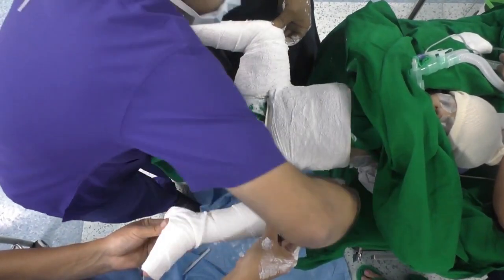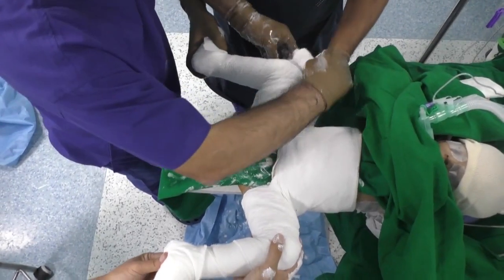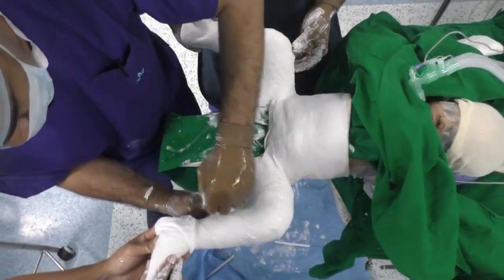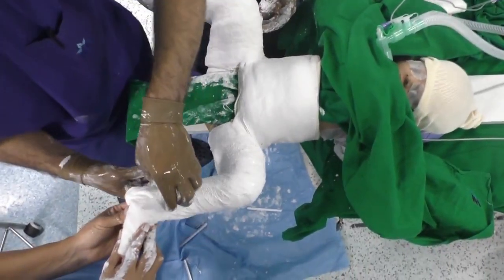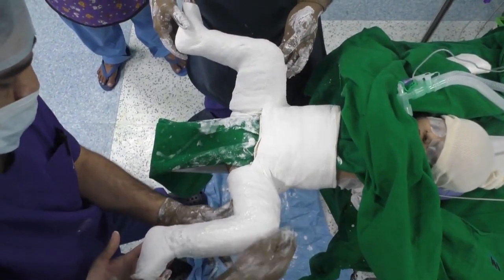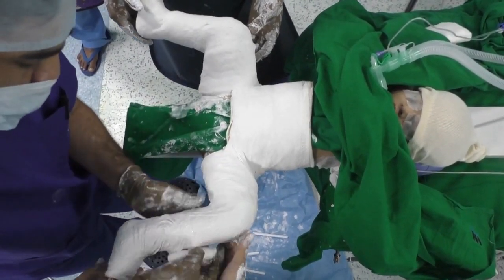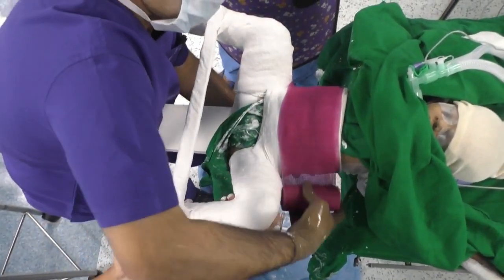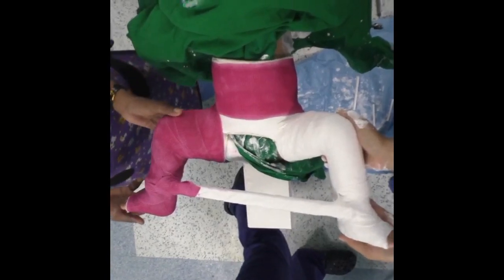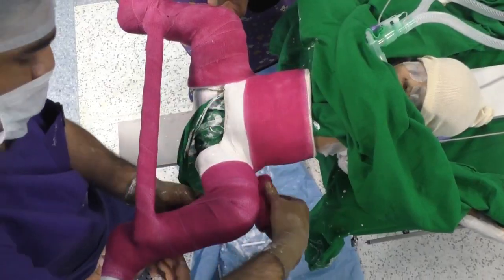It is important to apply the spica so that the perineal area is clear. You can notice that we have applied a green towel here which provides protection of the perineum and also for the abdomen. We are extending the spica beyond the knees and onto the ankle and foot. It is important to mould the spica well to make sure the edges will not hurt. The comfort of the child is very important. We have applied the bar now, and finally we are applying a layer of fiberglass plaster over this, so that the plaster doesn't get soiled. This makes the plaster lighter in weight and increases its durability.